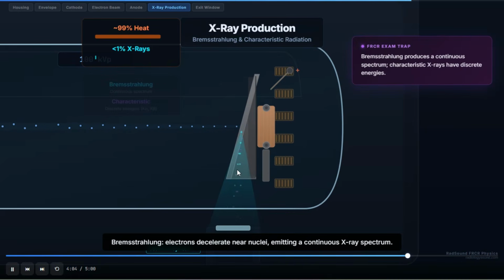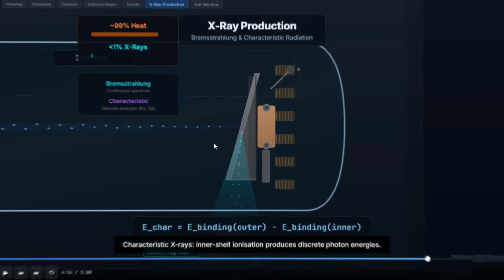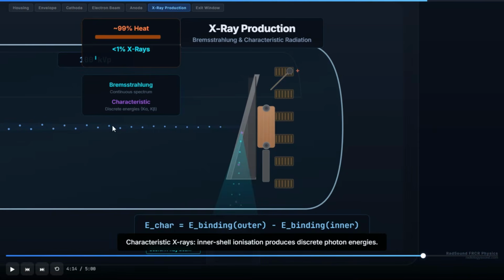the incident electrons have different energies. So it's continuous, whilst the characteristic radiation is discrete. So what's the process of production of characteristic radiation? The incident electron hits part of the target, that's the tungsten. It penetrates the outer layer, the middle, the inner. When it hits the inner shell, it hits some electrons inside the inner shell of the atom, and that electron will be displaced, ejected.